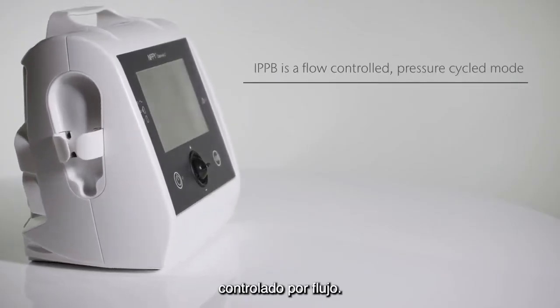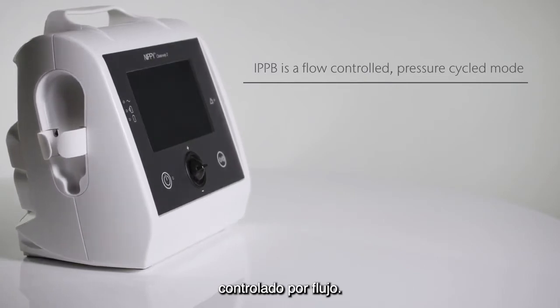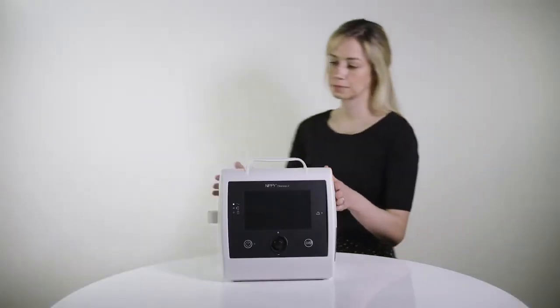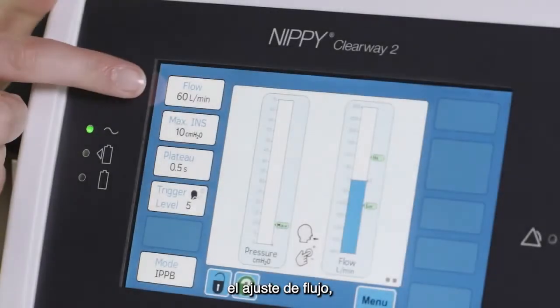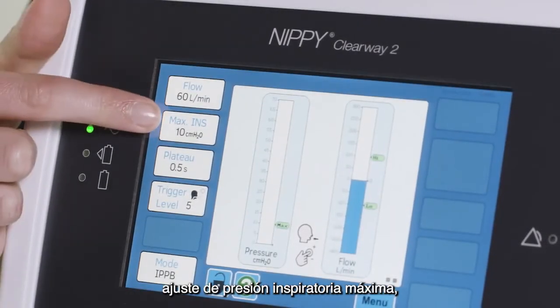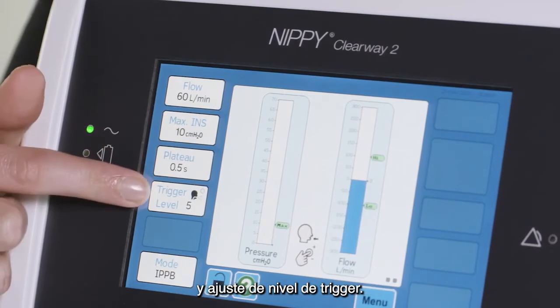IPPB is a flow-controlled, pressure-cycled mode. The main settings used are a flow setting, maximum inspiratory pressure setting, and trigger level setting.